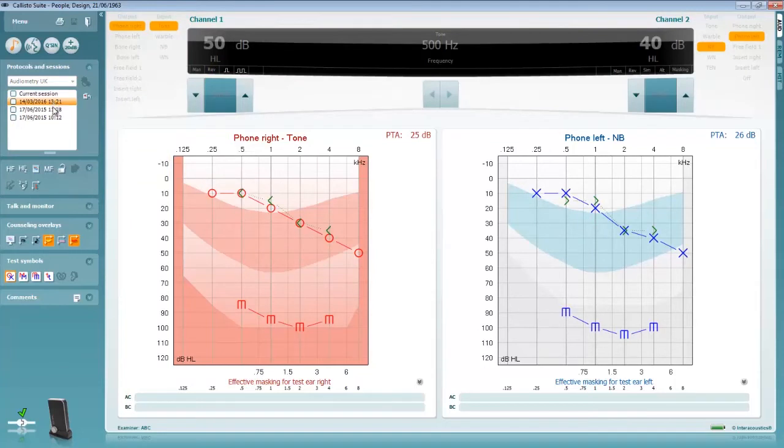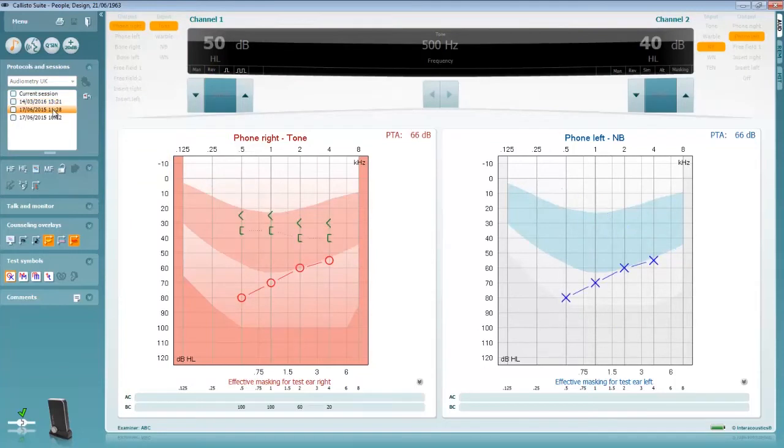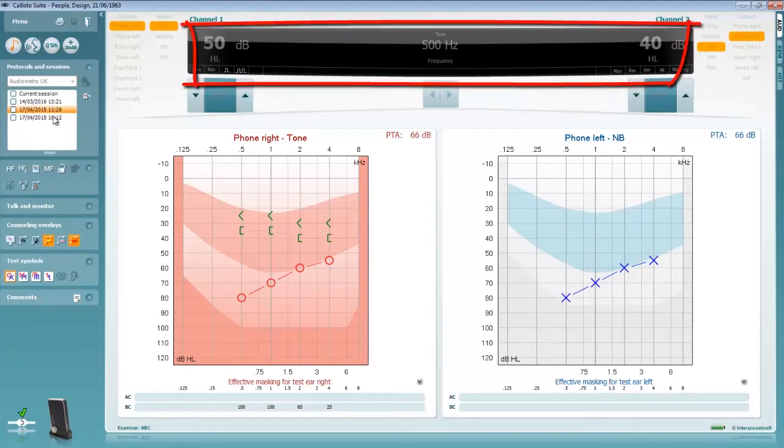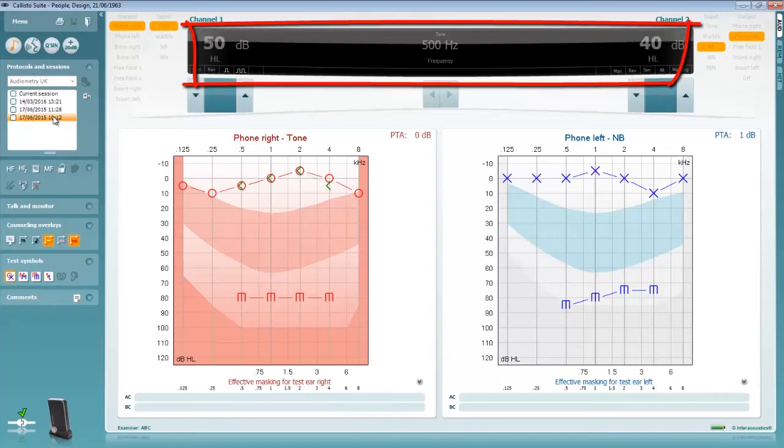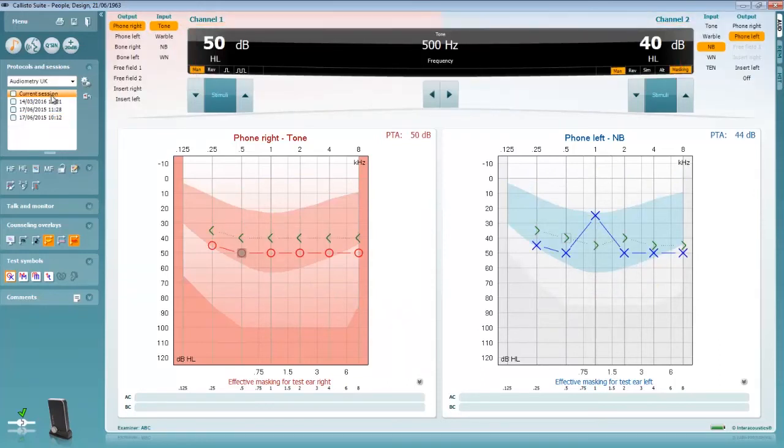To bring an older session into view click on the data to bring it up. Notice that when this is done the black box at the centre of the screen and the channel options grey out. This is because this is historic data and it cannot be modified.